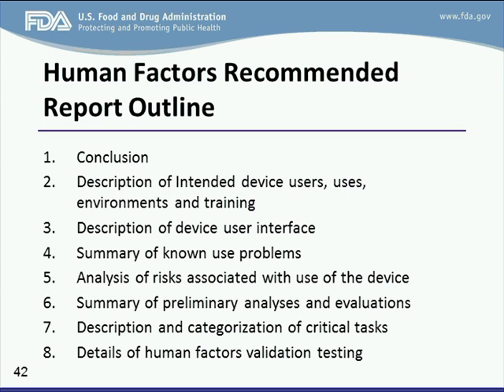Hi, this is Darren Keith. The focus of the guidance document itself, from a request perspective from the agency on what we would like to see to support the pre-market program, is the summative information. We think that the formative information is very helpful and useful, but we're not requesting or requiring companies to submit it. We would appreciate a summary description of what you did and what you learned from it, but not the detailed protocol or report.